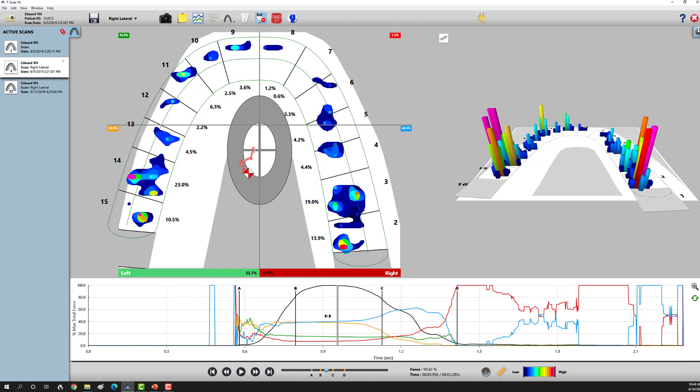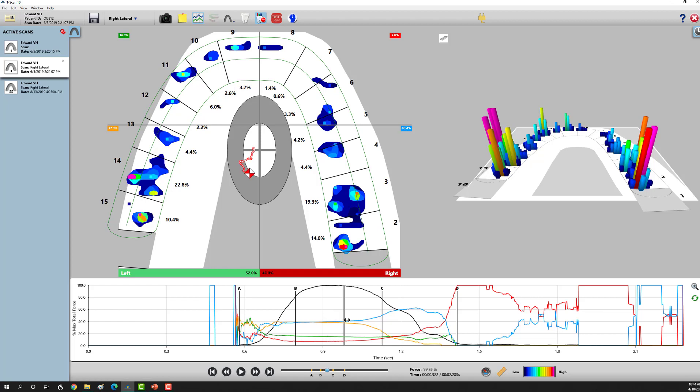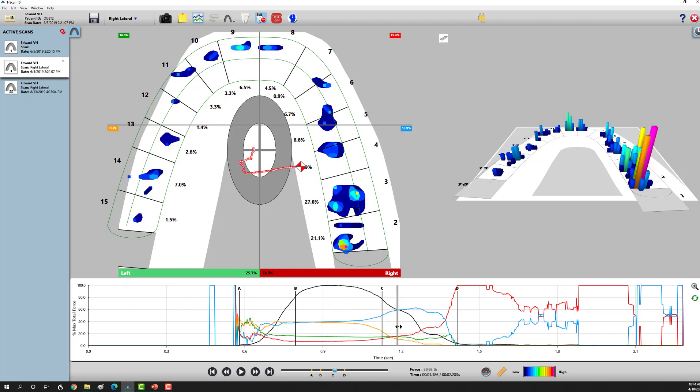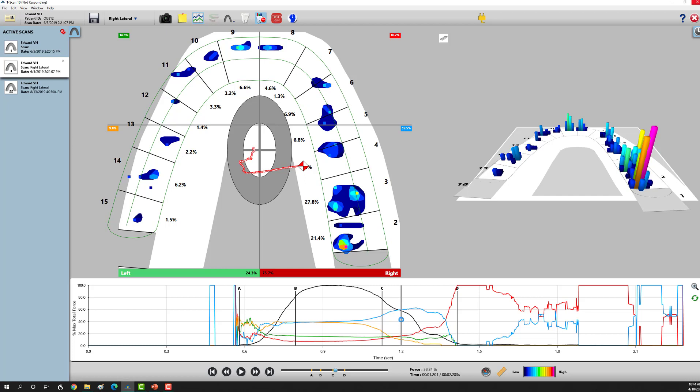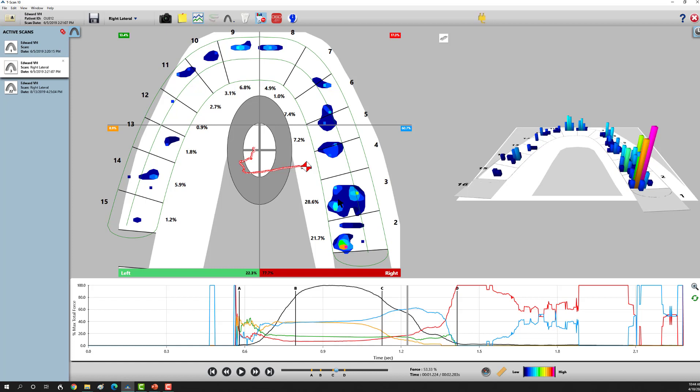He's going to move to the right, and we would expect the back teeth to disengage and the anterior teeth to engage. Most likely, we would like the canines to do that, but he doesn't have that. I've broken this up into quadrant view—each color represents a quadrant. Basically, he's discluding off of his two molars to the right. As he shifts to the right, tooth number three has the higher amount of force, although I suspect this has been going on for some time.